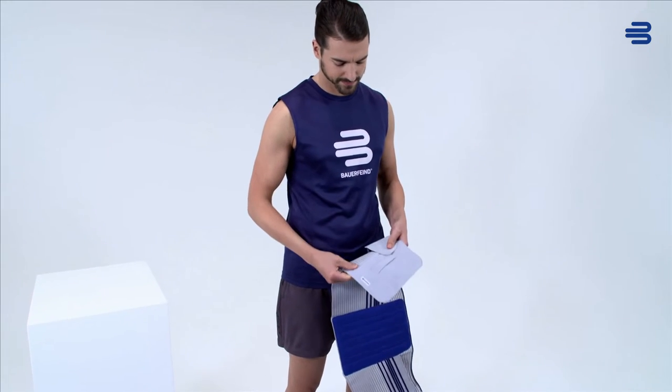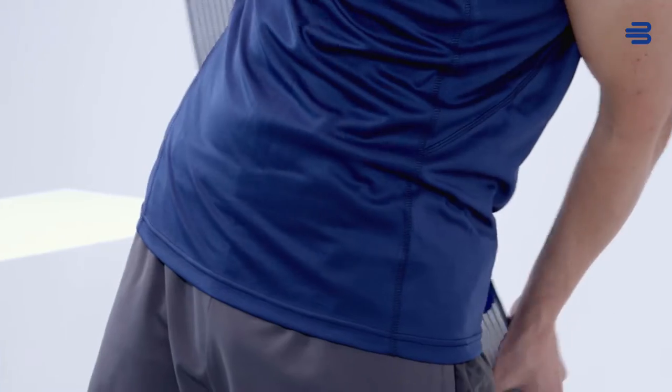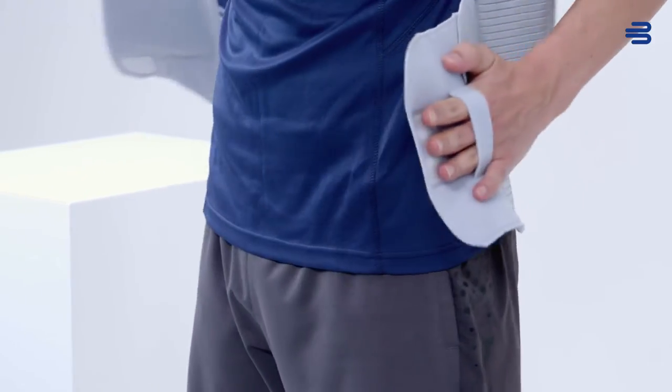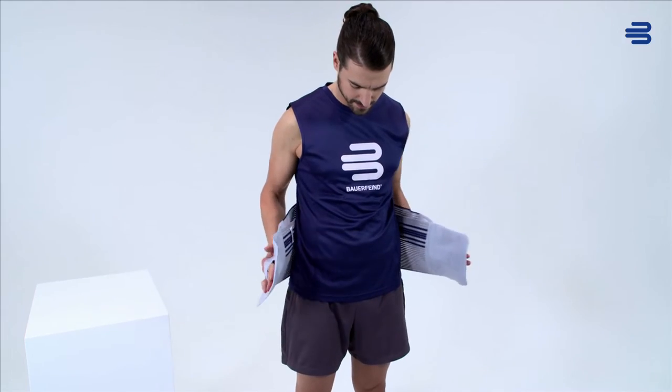Ask your patient to stand up and relax. The orthosis is positioned around the patient's back. The patient now inserts their fingers in the hand loops and, with bent arms and moderate force, pulls the lordo lock apart sideways.